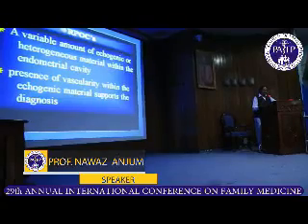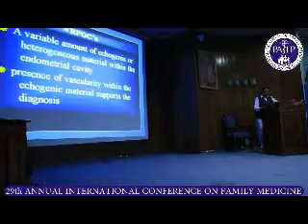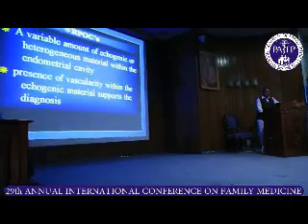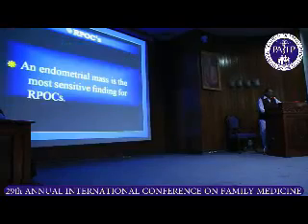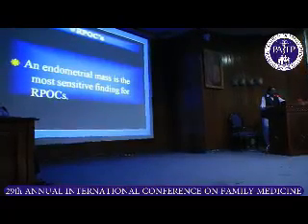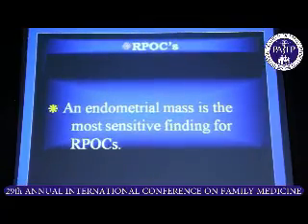RPOCs, usually after cesarean or after delivery, there is continuous bleeding and spotting, and they send the patient for retained products of conception. So the first thing you should see is an endometrial mass. It is the most sensitive finding of RPOC.